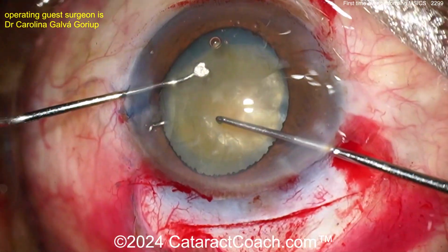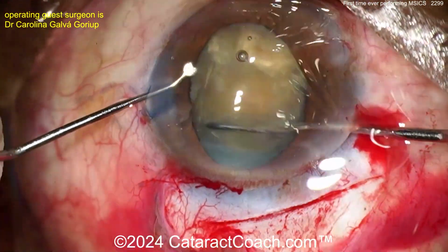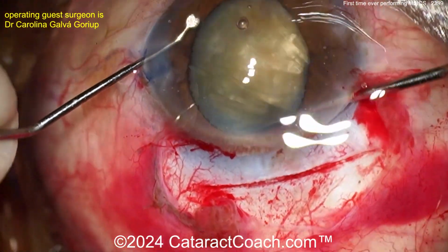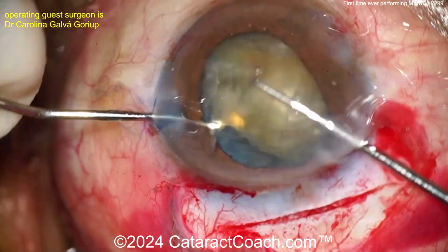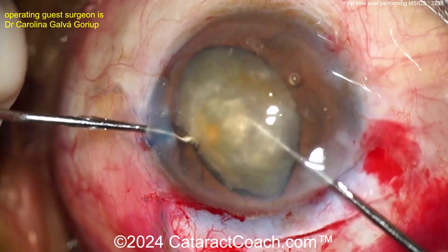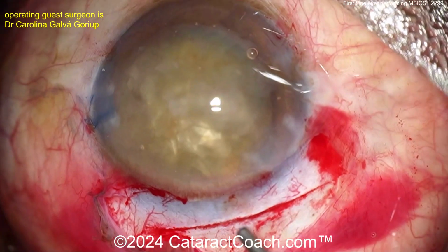Let's see the technique that's going to be done. I'll get the nucleus out of the bag with just hydrodissection here. But yeah, you can rotate it like this and kind of just ease it up into the AC. There you go. Once you get that other instrument behind it, there it is. Bring that baby up. You got it. There it is, on top of the eye. Now it's going to be easy.